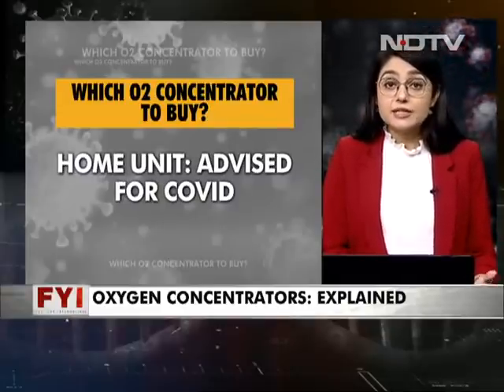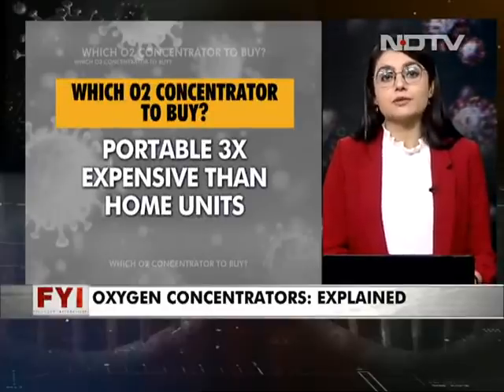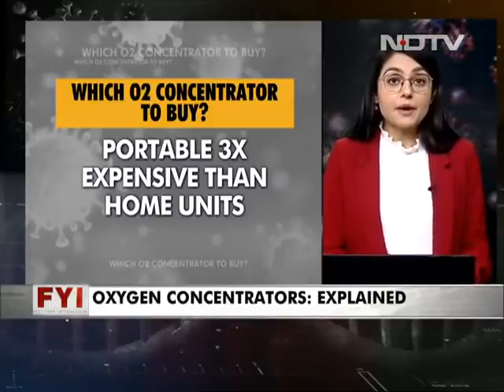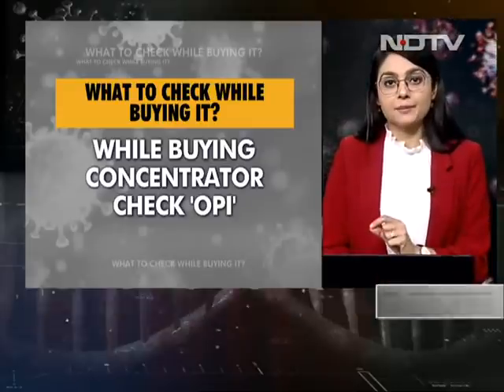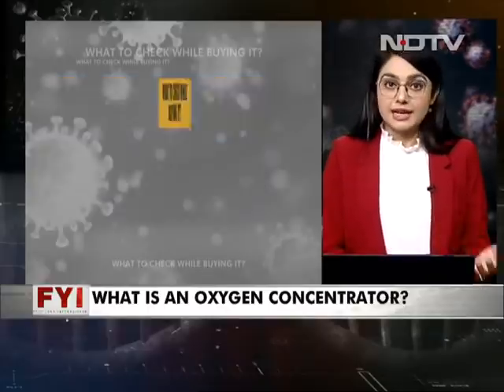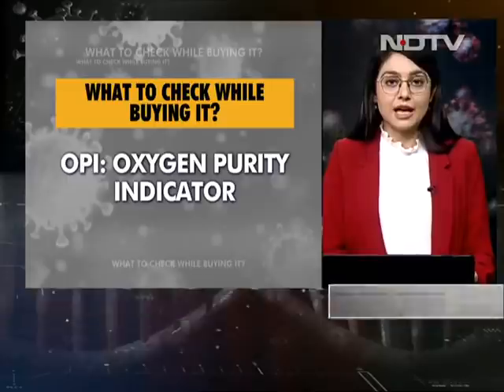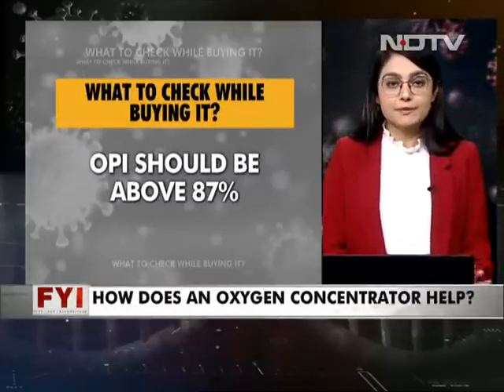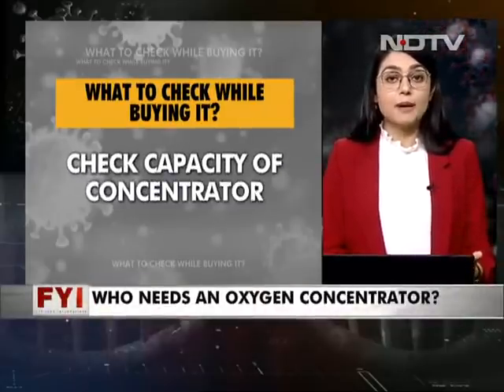So when dealing with COVID, a home unit is the preferred choice. If you look at prices, a portable oxygen concentrator is usually 3 times more expensive than a home unit. Next, very important to remember while buying an oxygen concentrator is checking its OPI, meaning the oxygen purity indicator. As the name suggests, it is the purity of the oxygen that the concentrator is outputting. It should not be below 87%. That's absolutely essential.